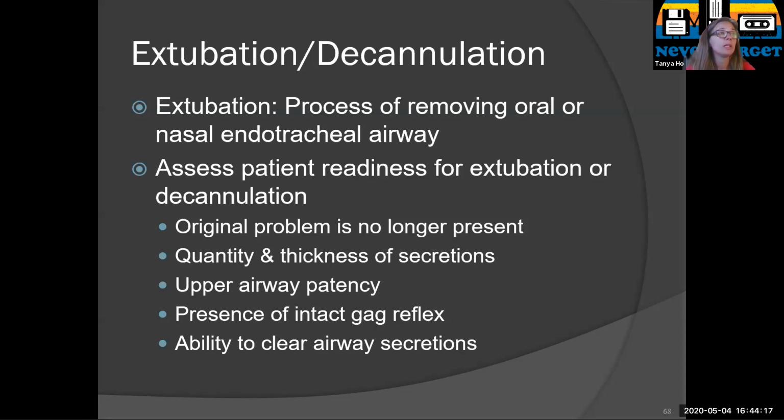You're going to first make sure that they're ready, because you want to be sure that the patient is able to sustain ventilation on their own and also be able to protect their airway.